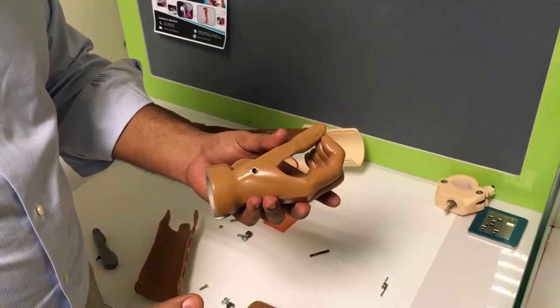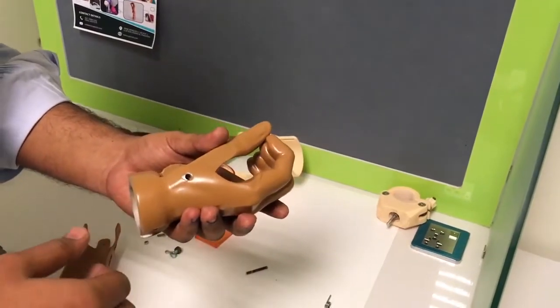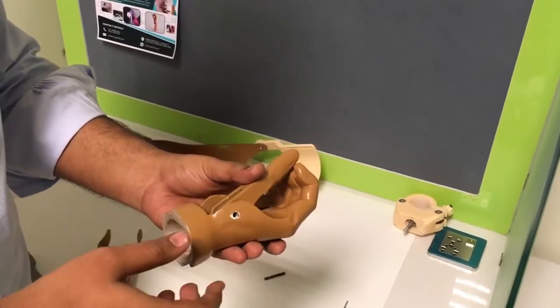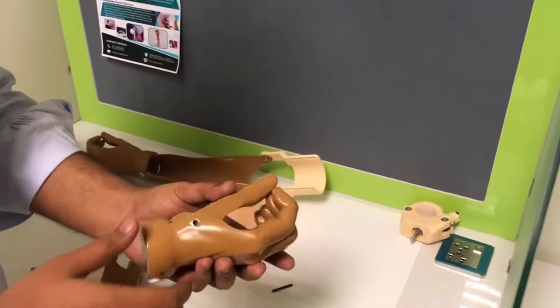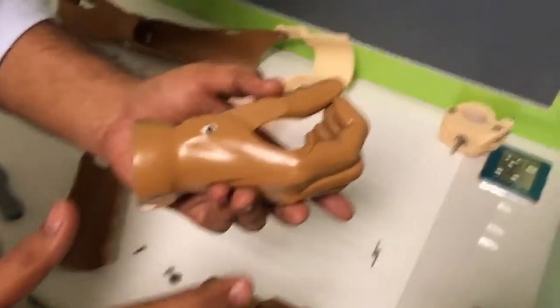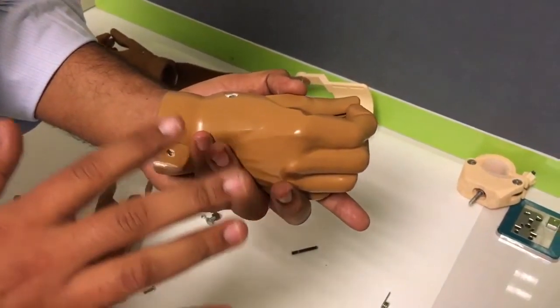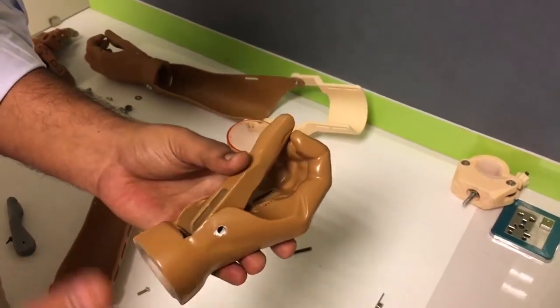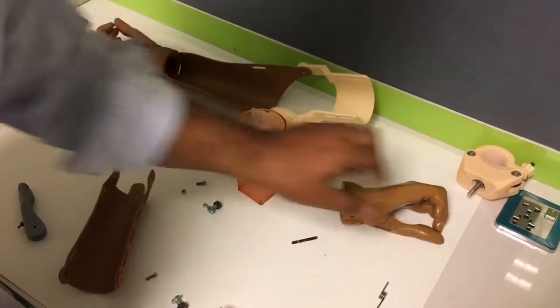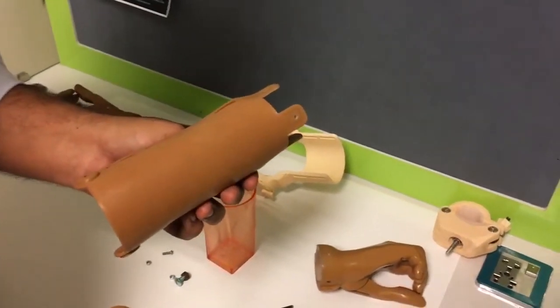Coming towards the material used for printing: the palm and thumb are printed in ABS. It can also be printed in PETG, which is not recommended, but PLA is strictly not recommended because in high temperatures it wears off a lot and breaks. ABS is recommended, and it also gives a good finish when painted. It is painted in deco paint — the way cars are usually painted — because it gives a good texture, as you can see, and aesthetically it looks good.